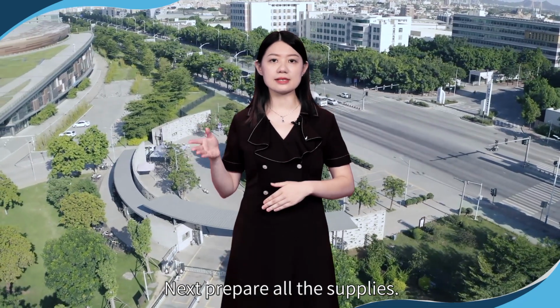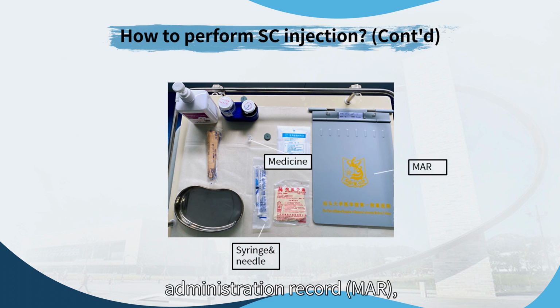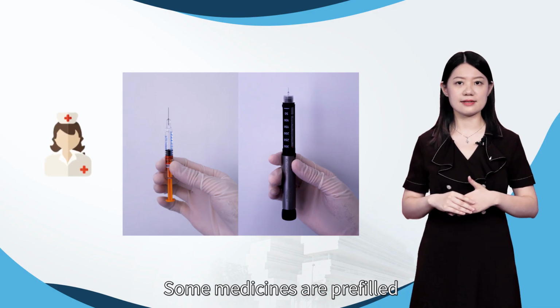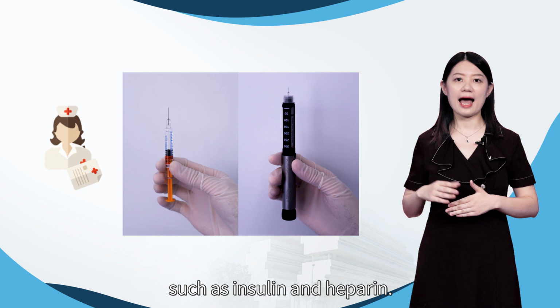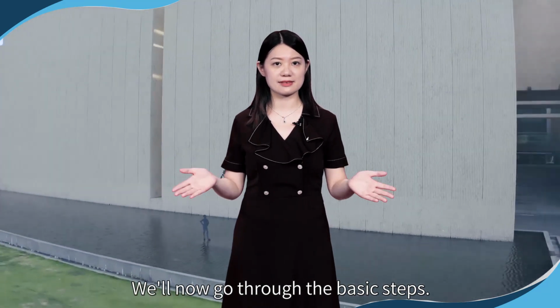Next, prepare all the supplies. We set up a tray with a sterile syringe, 25-gauge needle, and the medication prescribed. Prepare the medication administration record, MAR, antiseptic swabs, gauze, clean gloves, a kidney basin, and hand sanitizer. Some medicines are prepared with special syringes and needles, such as insulin and heparin. How do we carry out SC injection intervention? We'll now go through the basic steps.